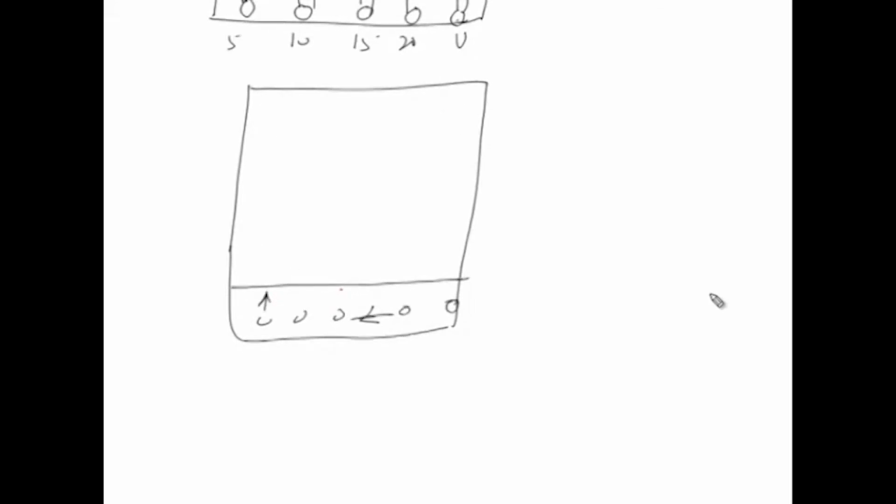Now, as they run in this direction, at 90 degrees, you will get different patterns, because there will be a lot of mixture. As complex as the mixture is, the pattern will be that complex. So, two dimensional rocket immunoelectrophoresis could be performed, or it could be one dimensional immunoelectrophoresis. Both ways it could be performed.